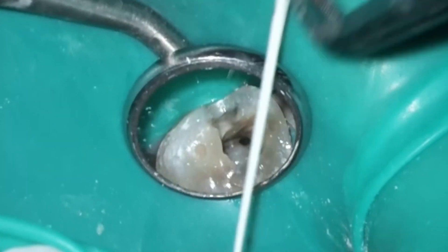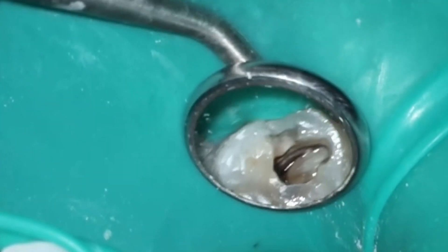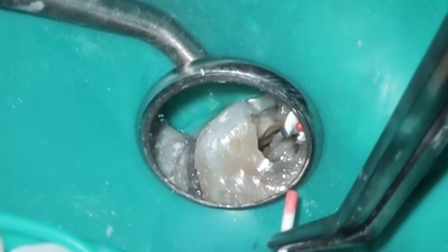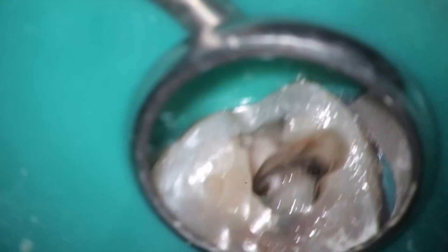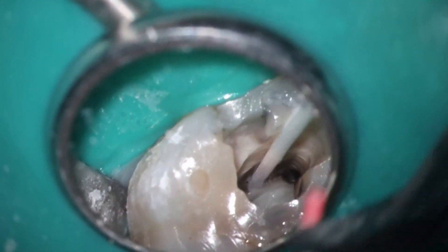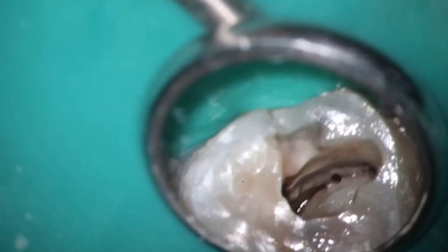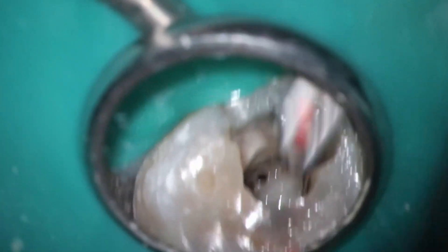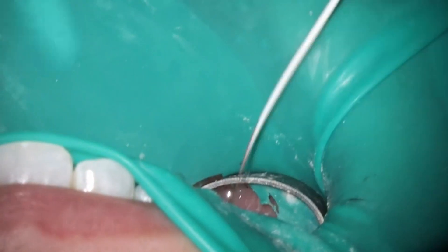This is a good test to see if you have a dry paper point — if it is wet, it will bend because it loses its structural integrity. This is a strong, hard rule for me: if I cannot get the case dry, I will not complete it, and we'll use something like calcium hydroxide in the interim. Some of you may be asking: you have a fancy GentleWave, why don't you use it here? On curious cases I tend to not like it as much — it tends to leak a little bit more. In this case I had already done most of the work, and if we weren't able to get it dry, we'd stop here.